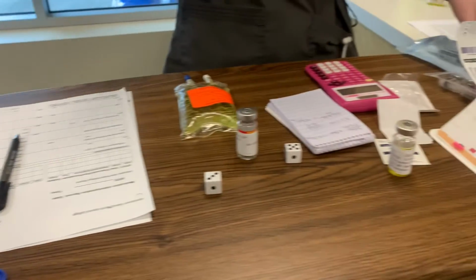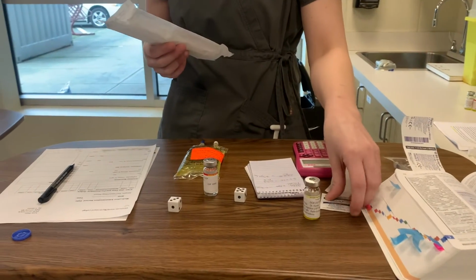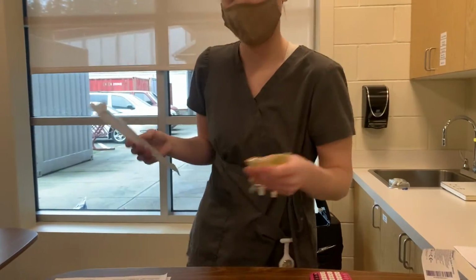Perfect. So heading over to the patient's room, I need to make sure I have my 10 milliliter saline lock. Need to have an alcohol swab to be able to wipe the saline port. And I have my medication here. So I'm good to go.